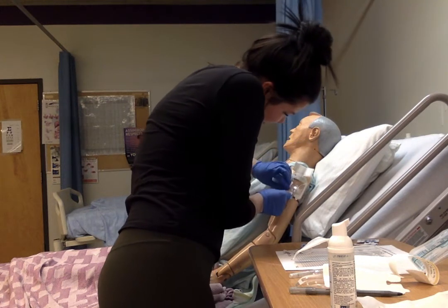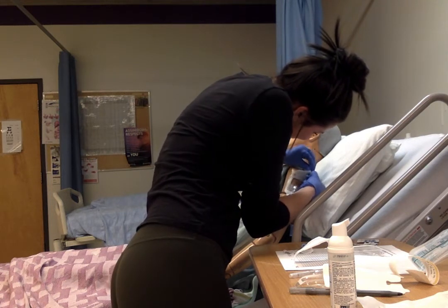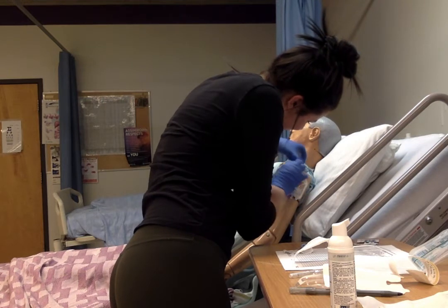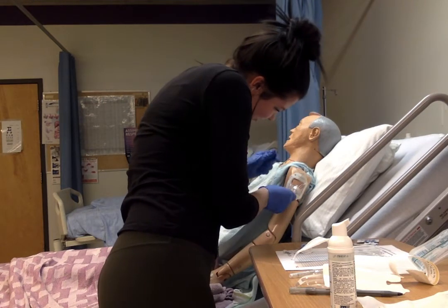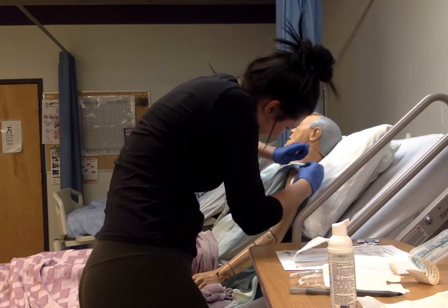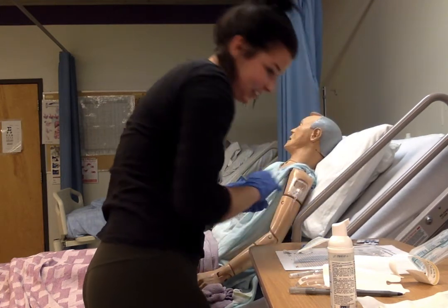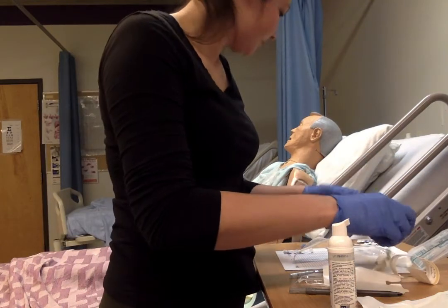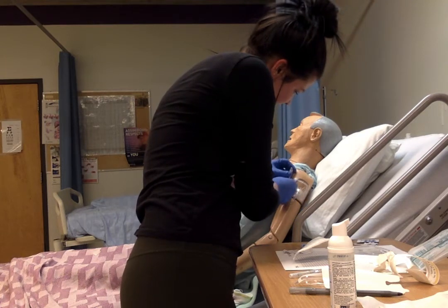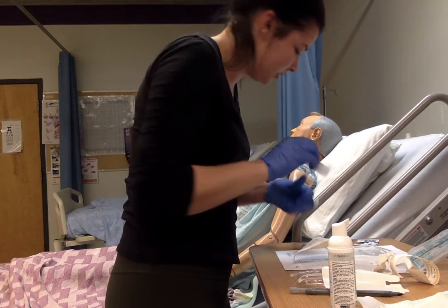And now I gotta try and get this thing off. Oh God. Okay. All right. Okay, that's on. Now we want to fully secure everything here. We'll move this little clamp up to the top, and we want to make sure that we have our label in here.